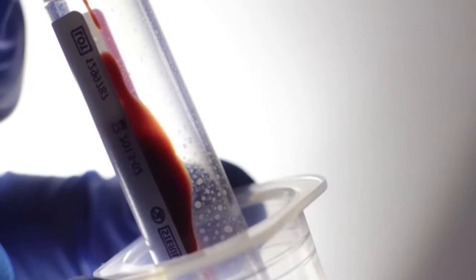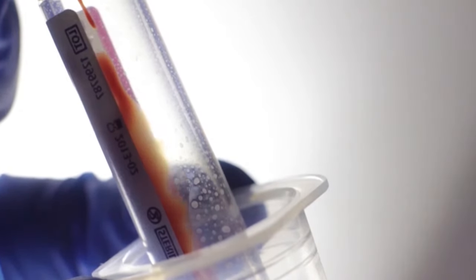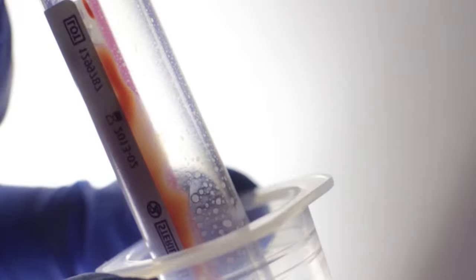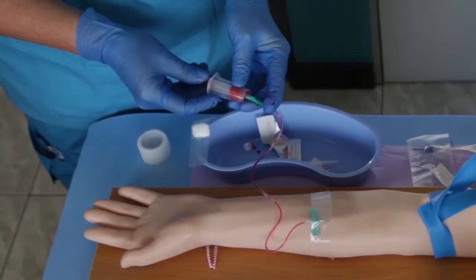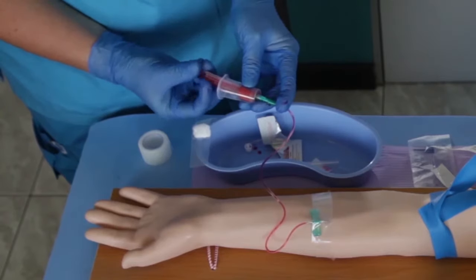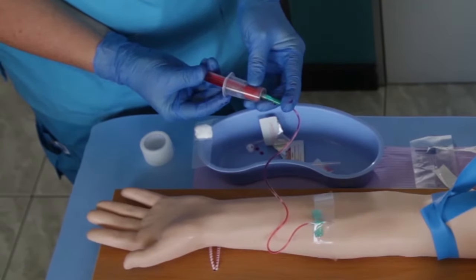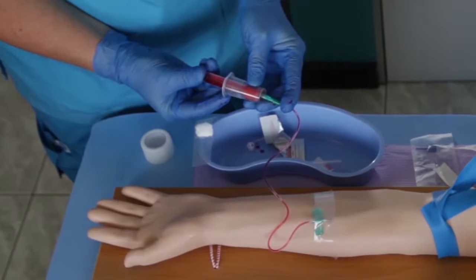Firmly press the vacutainer tubes into the vacutainer hub and fill the tubes in the correct order. It is unlikely that the butterfly needle will slip out of the vein. Allow the tube to fill and then remove it from the hub when the blood flow stops. Remove the filled tube by holding the hub securely and pulling the tube off the needle inside the hub.